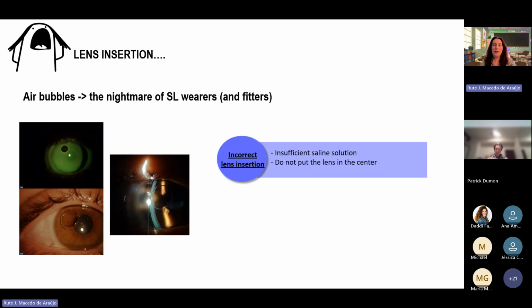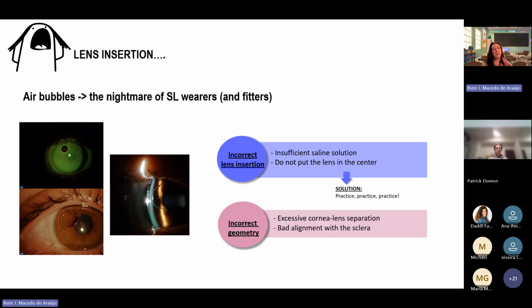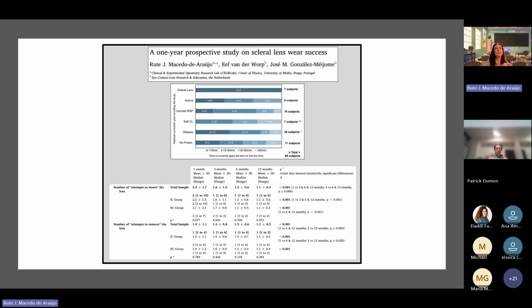So a nightmare for the scleral lens wearers and also for the fitters is when we are inserting a lens and there are air bubbles there. It can happen because of incorrect lens insertion, and the only solution is to practice. But this also can happen because of incorrect geometry of the lens, and we will see a video later on in this presentation about that. And the solution here, of course, is to change the lens parameters.